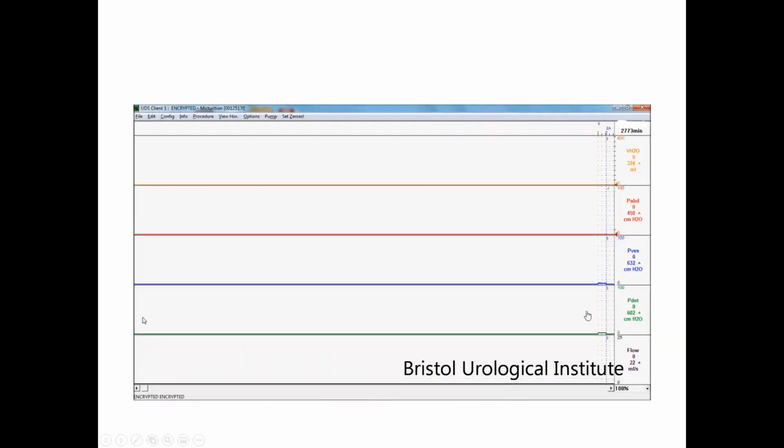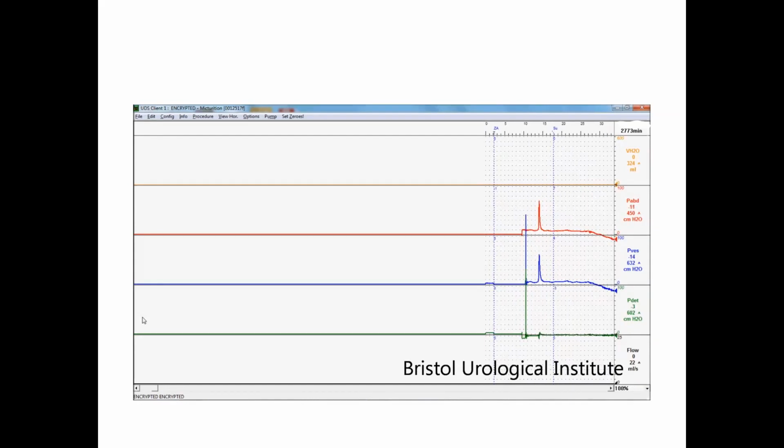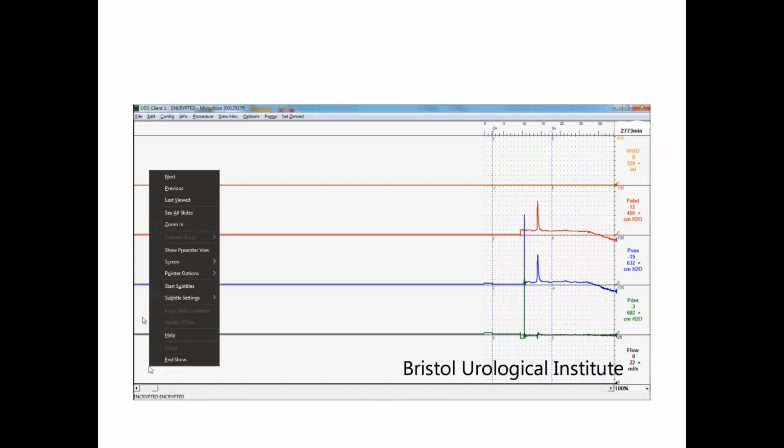Okay. We've got one final one before I hand over to Marcus. So let's just have a little look at this one. Okay, so it's on, it's recorded from our patient. It's a good cough test. And then what's happening? Okay, so this is what starts to happen during your test. What's the first thought? It's the first thing that anyone would be concerned about. It's on both lines, and it's a change in your resting pressure below 0.